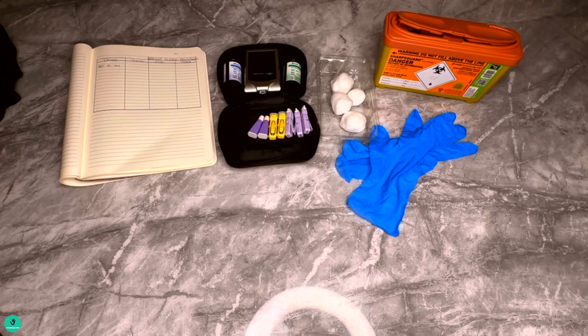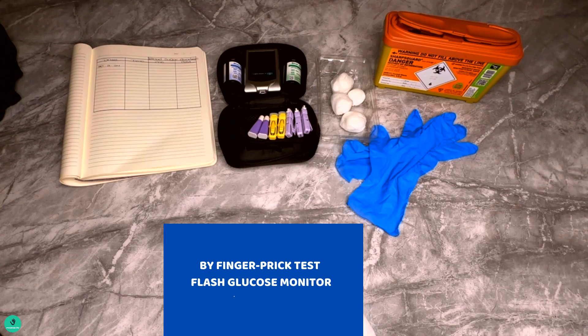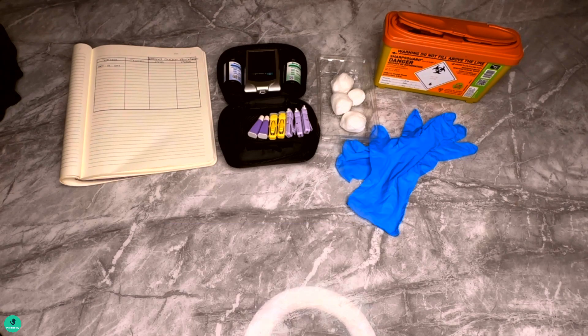There are two ways that you can use to check for blood glucose level. The first one is by finger prick test, which is very common, and another one is a flash glucose monitor — this is like a sensor that's put on your body to sense for blood glucose. In today's video I will be focusing more on the finger prick test.